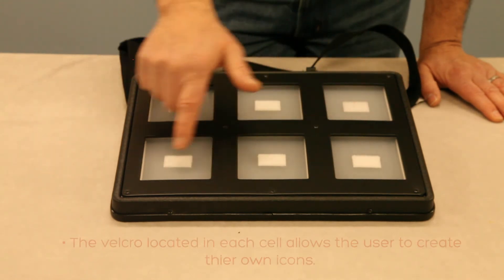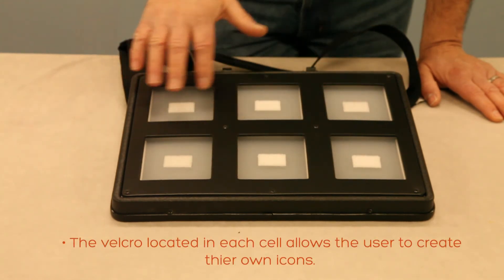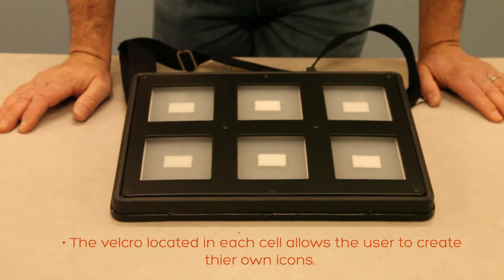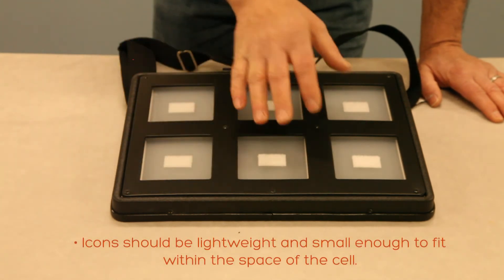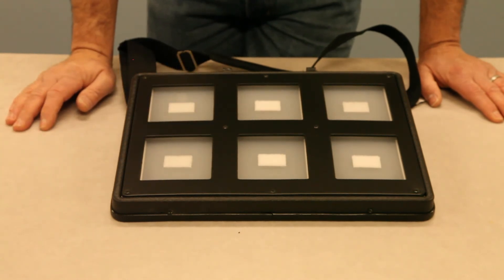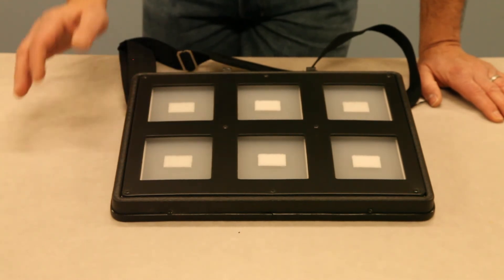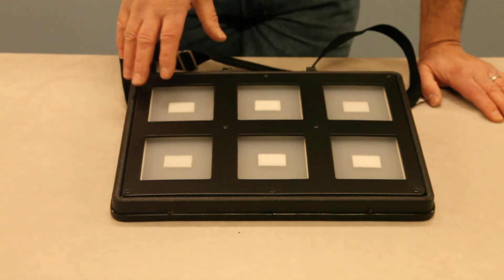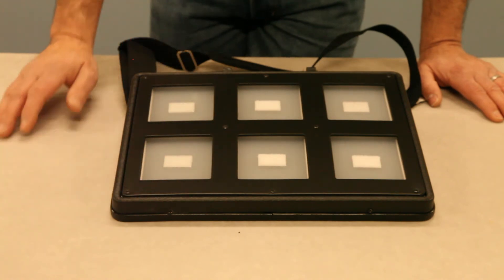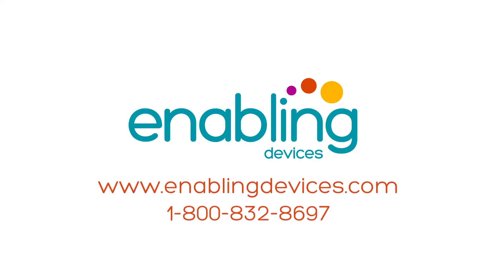Because this is a symbol communicator for someone who is visually impaired or blind, we've added a Velcro piece on each one of the switch plates so you can use your own symbols with this device. If you want to put small objects on them, keep in mind this is a light-activation communicator, so the objects you use need to be fairly small within the cell area and also pretty lightweight.